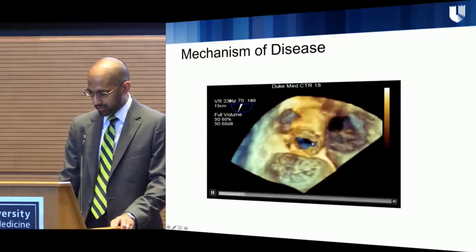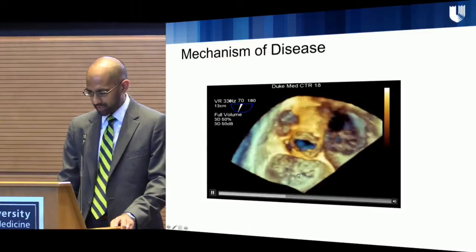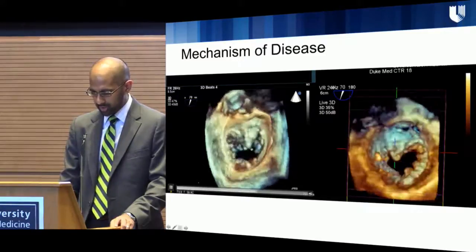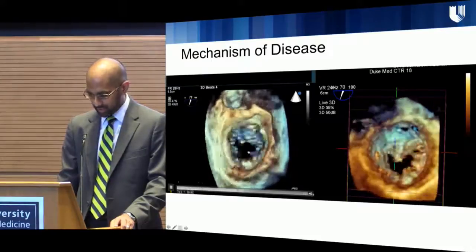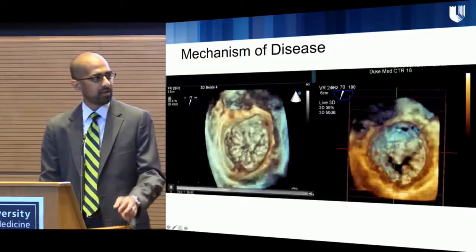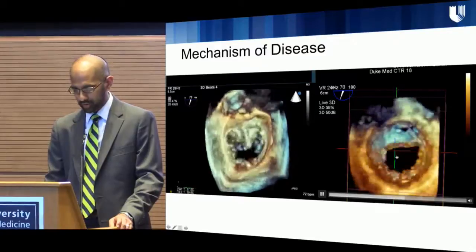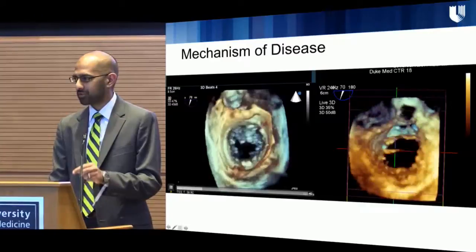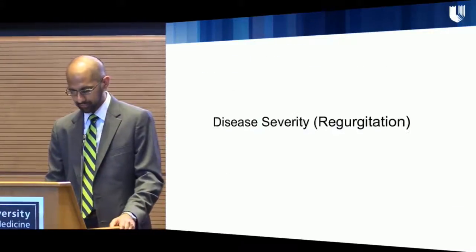So in the middle, we've got the aortic valve, tricuspid valve out here, pulmonic here, and here's your mitral valve. And I'm actually going to show you an even better picture, higher resolution, higher frame rate. And what you can actually see is there's a little flail segment here to the anterior leaflet, and you see this thing spinning around right here. That's the cord flipping back into the atrium, and this is the same thing from a ventricular view. So I think you could argue without data here at least that it might be easier and faster to assess exactly what's going on with the mitral valve with 3D imaging.